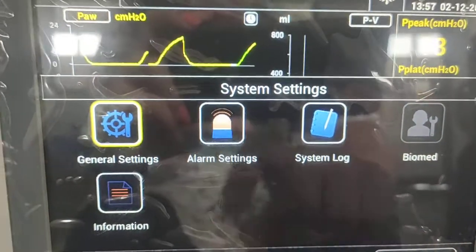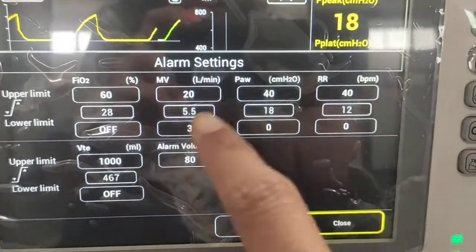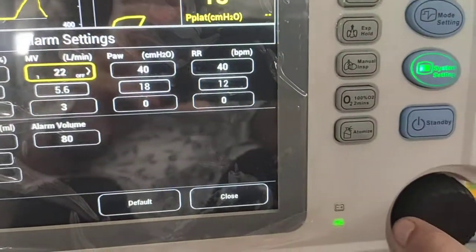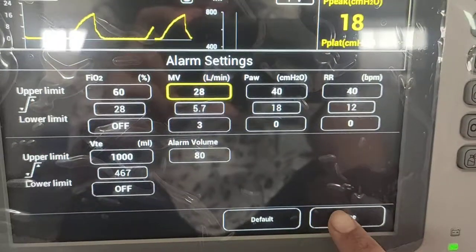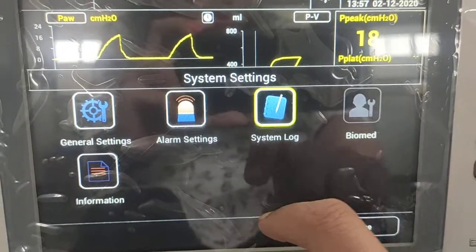In alarm settings, various parameters are listed where you can set the limits for each parameter. Use the rotary knob to select a value and press to confirm. To save the changes, simply close the menu. After that, system log information is also available.